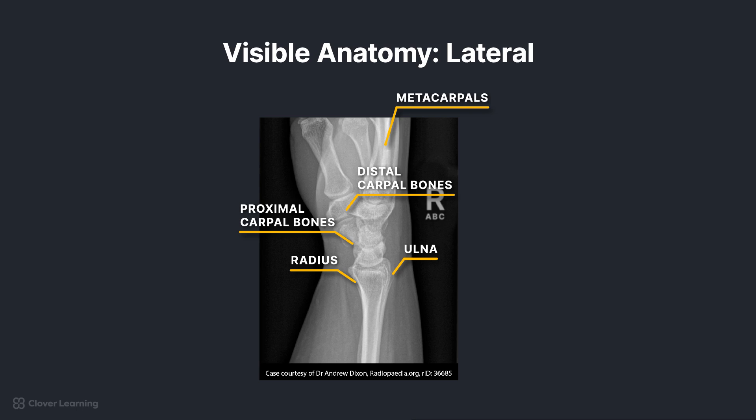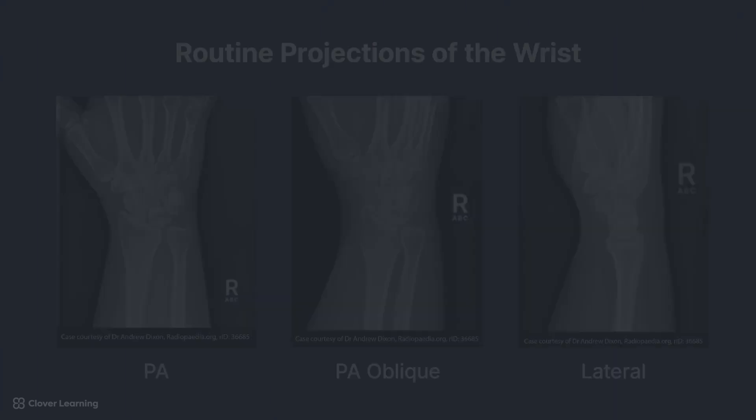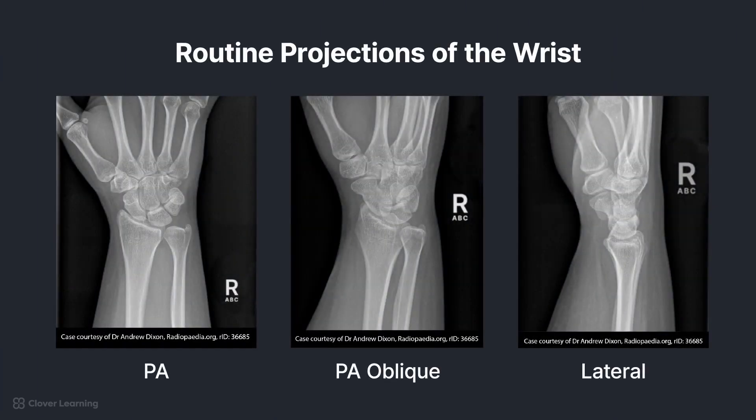Were you able to correctly identify the anatomy in these images? In summary, the routine radiographic projections for the wrist include PA, PA oblique, and lateral. Obtaining clear, diagnostic-quality images of the wrist can help identify fractures and other pathological conditions. Identifying and recognizing the relevant anatomy is the first step in ensuring the evaluation criteria are met.